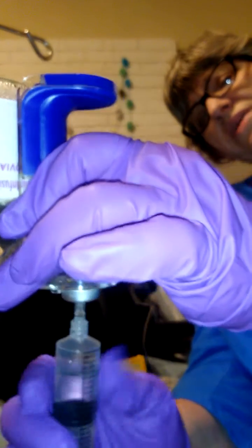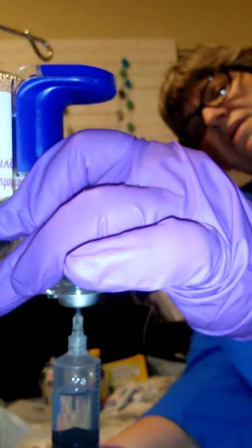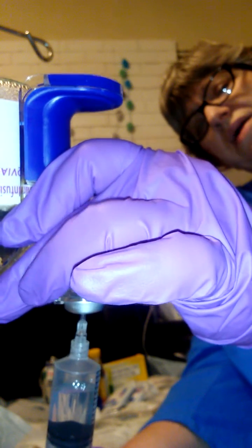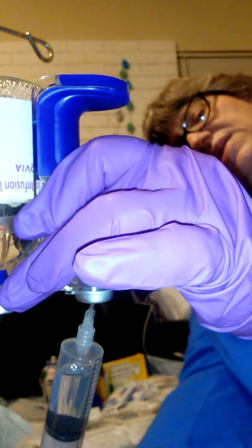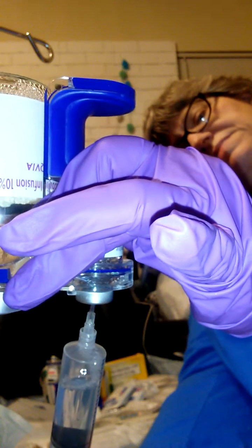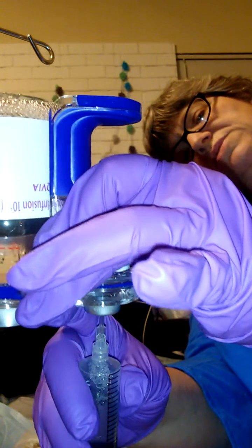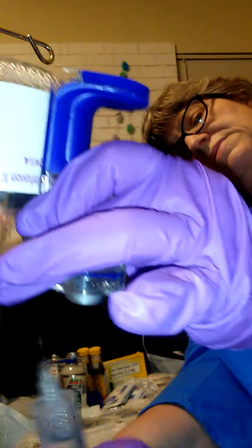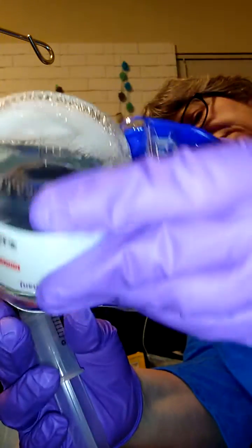Now, you do pull down on this to make sure you get every drop. A little bit of air going back in there. Pull down just a little. This is liquid gold, y'all. We do not waste any of it. You do get a few bubbles in there. Get out as much of that as you possibly can. If you need to wiggle this around a little bit and see what you have. I think you have all of it. Yes, nothing left in there but a few air bubbles.